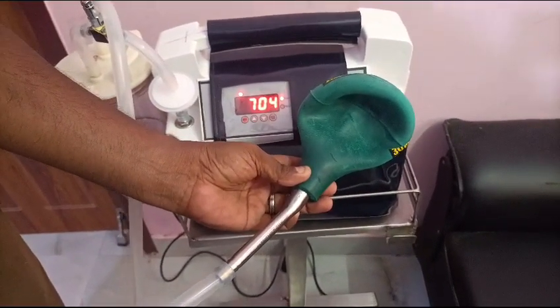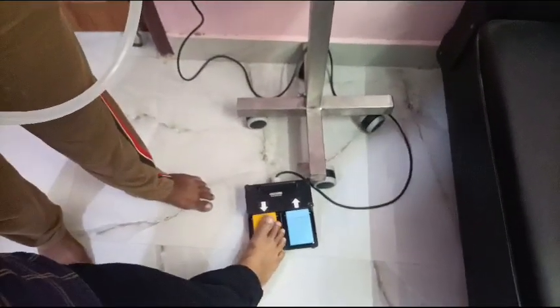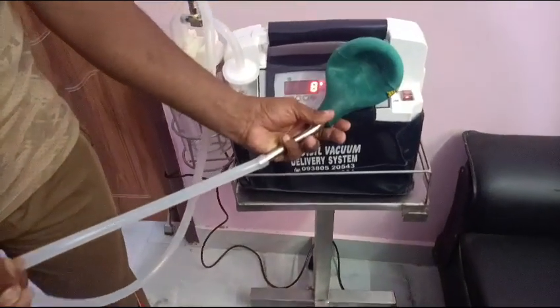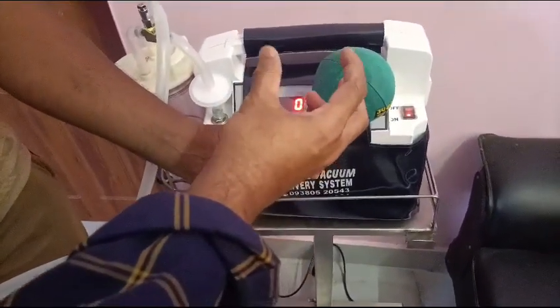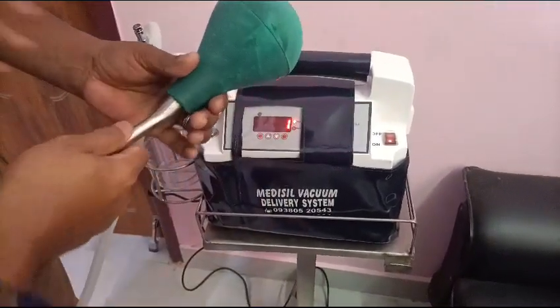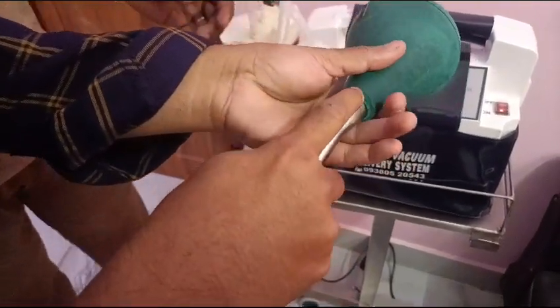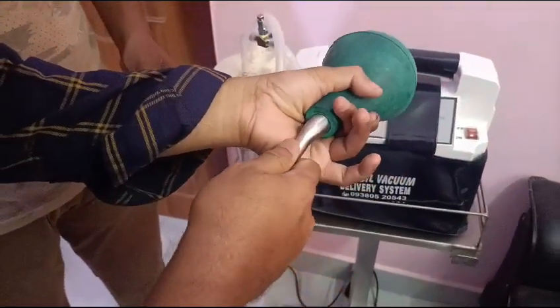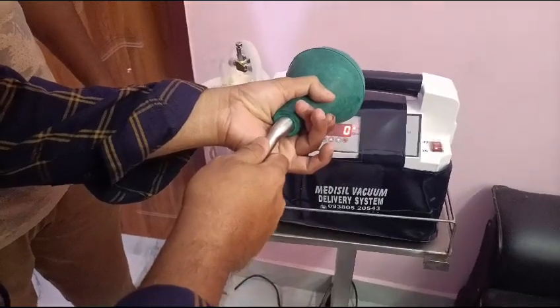So after 30 minutes of the procedure, you press the other one and the vacuum gets released. The uterine cavity will be slowly getting up. Then you put the fingers inside, and slowly after 10 minutes, slowly release and remove the tubing from the uterine cavity. Thank you.